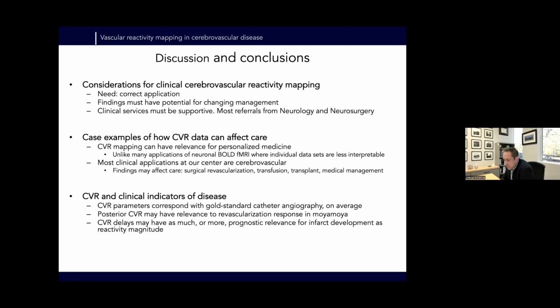And this is one example where I think, we actually don't do a lot with BOLD in our lab. We use mostly other quantitative methods, but I think really for reactivity imaging, BOLD is quite good and can also be useful on a single case basis for interpreting the physiology of a patient, which is very difficult with functional connectivity and neuro applications. Right. And then I showed some examples of how you might be able to use this to affect surgical revascularization decisions.